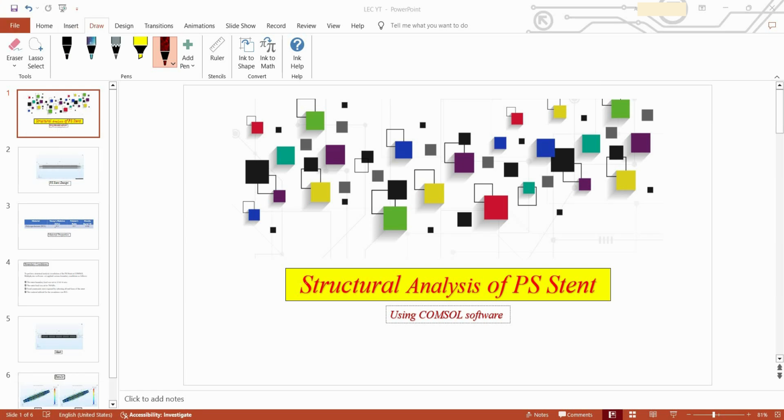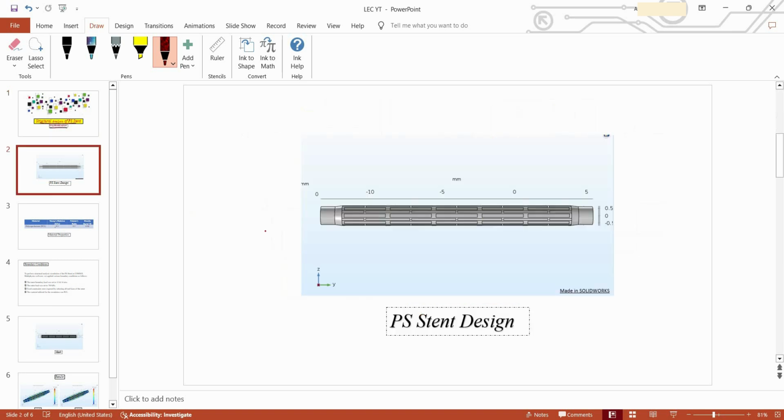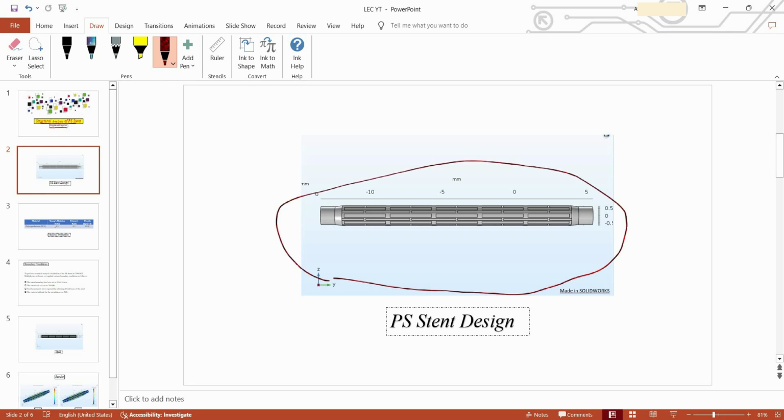Hello guys, today we are going to see structural analysis of PS Stent using COMSOL software. So this is the PS Stent design which we have made in SolidWorks. This is the standard design, and the dimensions of the design we have taken from some research paper.